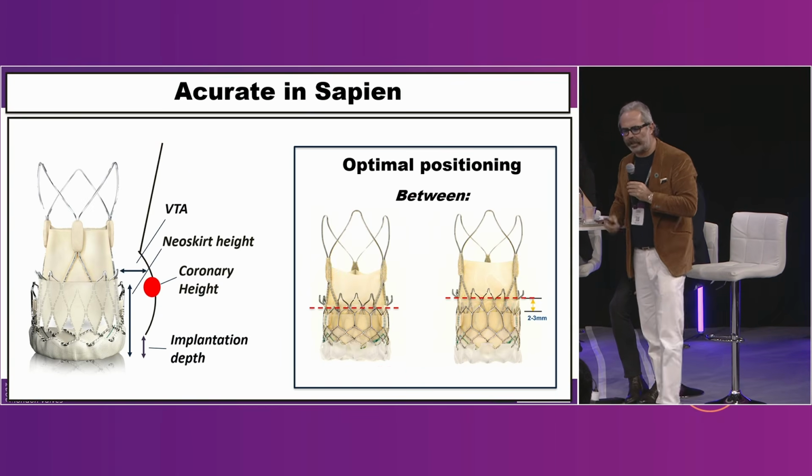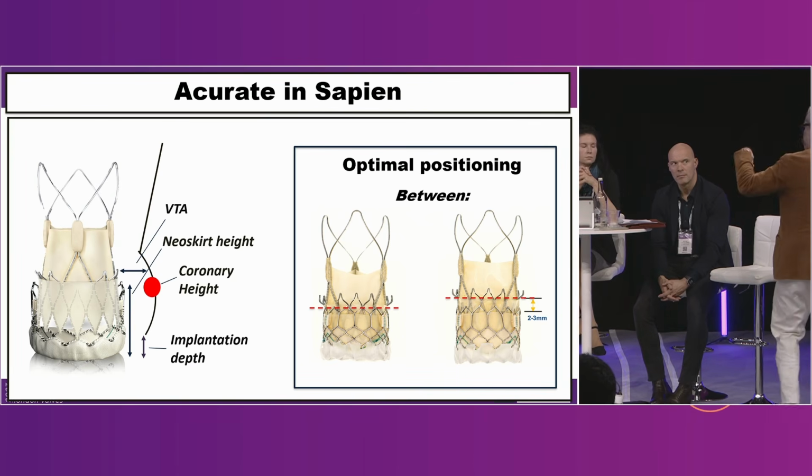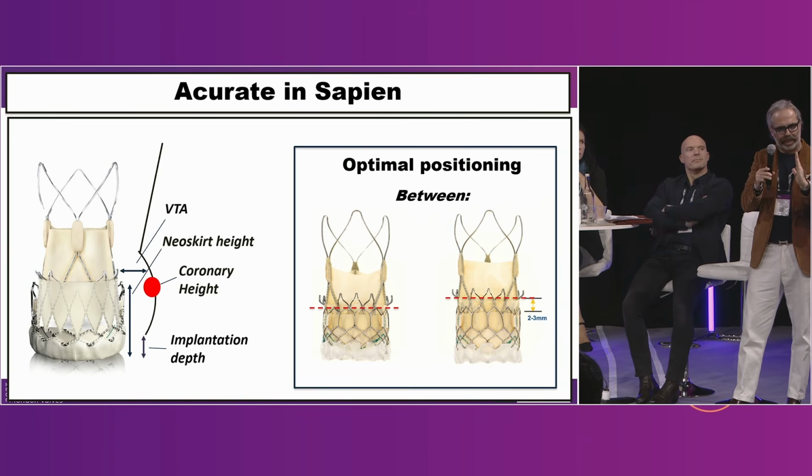Okay, what is the risk if you go too low? This is pretty much the same as with the bicuspid valve. If you stay too low, you have a restriction that is created by the struts of the Edwards, pretty much like the raphe in the bicuspid valve, and because of the hook, you cannot expand the ACURATE. This might be one problem. So you need to stay above with the hooks compared to the top row of the Edwards, and you don't have to stay too high, otherwise it's very difficult to tilt up completely and smash the leaflets of the SAPIEN that stay before in. If you have any other comments, you can add something.